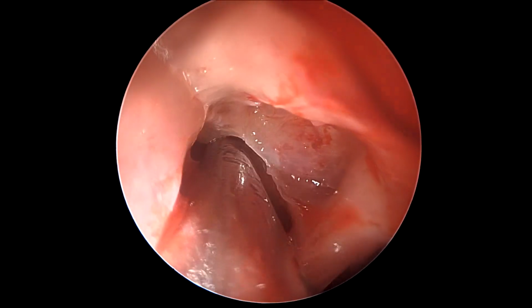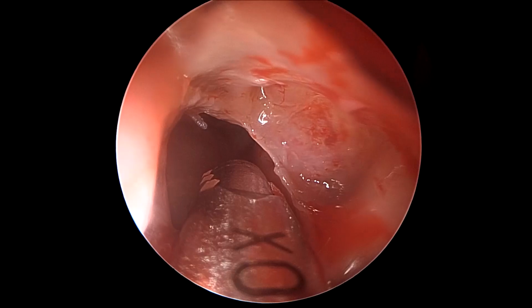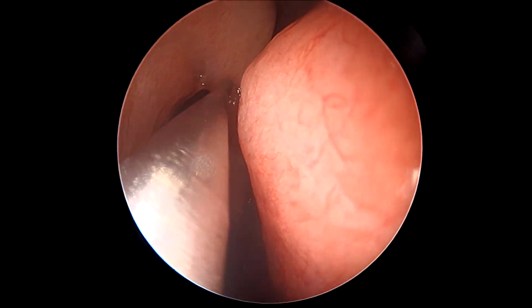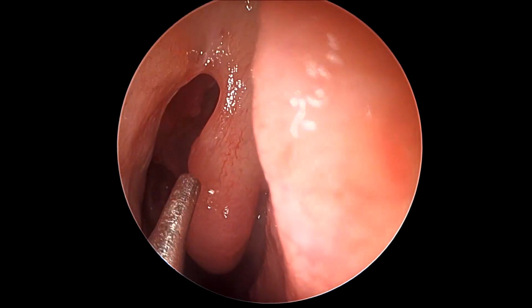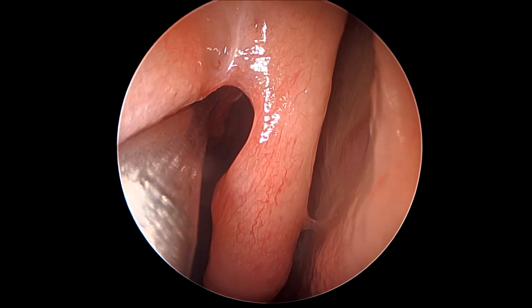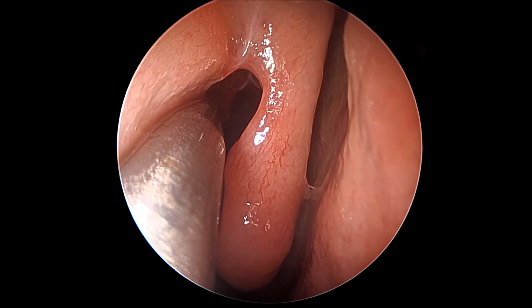And just like the other causes of revision, removing all the possible causes of failure, such as any remnants of the uncinate process, opening of the frontal recess, removal of all the ethmoidal septations, wide opening of the sphenoid, and management of any possible issues like deviated septum are very important to ensure the eventual success of this second surgery.